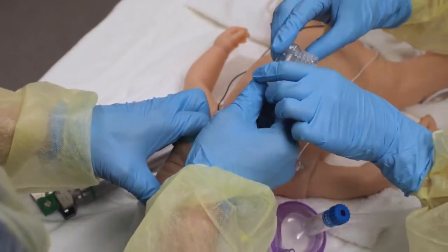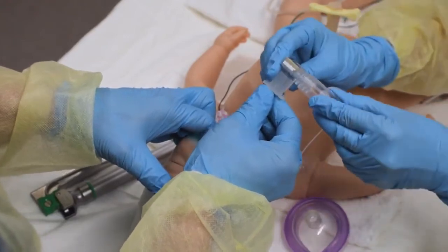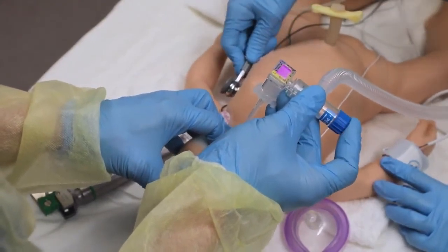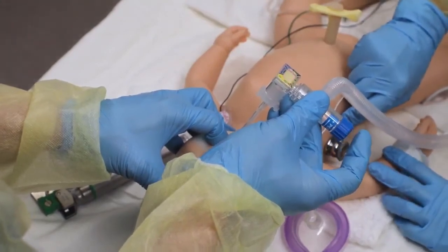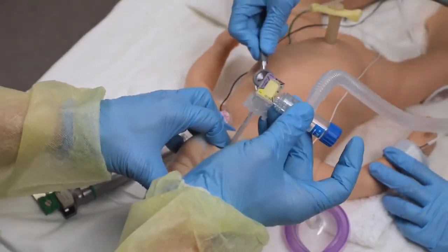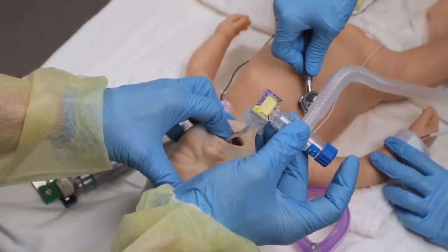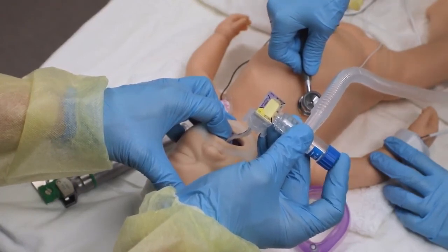Let's put on the CO2 detector. CO2 detector's in. All right, I'll take this. Can you listen for breath sounds? Listening for breath sounds in the axilla. I hear breath sounds on the left. I hear breath sounds on the right axilla. Okay, I see good chest rise, and I have mist in the tube, and I have color change. I hear heart rate, and it's rising steadily. I hear good breath sounds on both the left and the right.